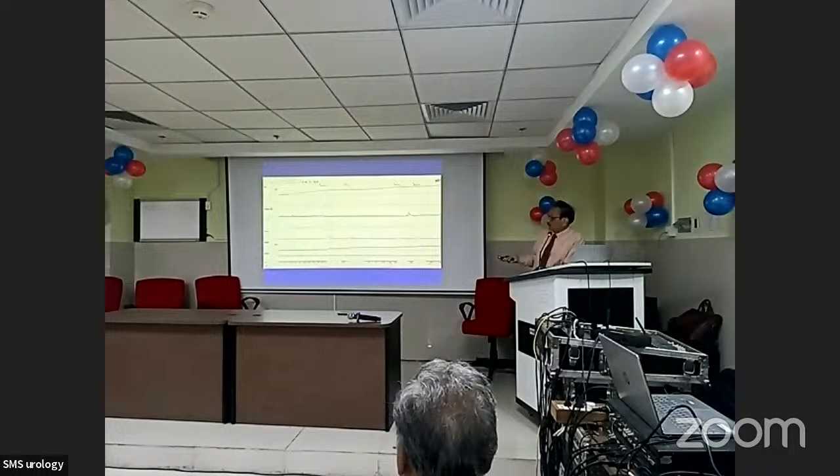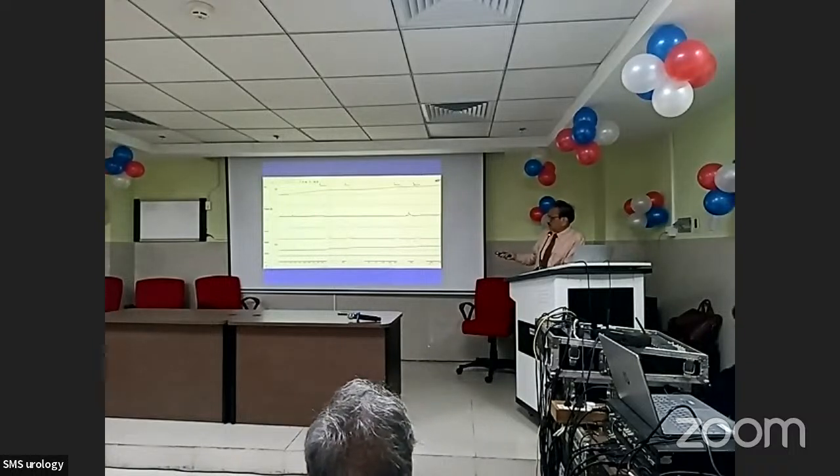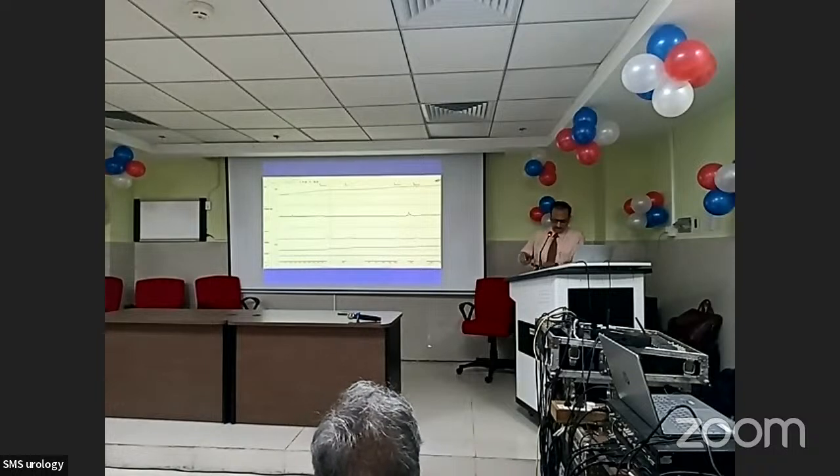Can anybody tell me what this shows? This is the storage phase. Intravesical pressure, detrusor pressure. What does it show?